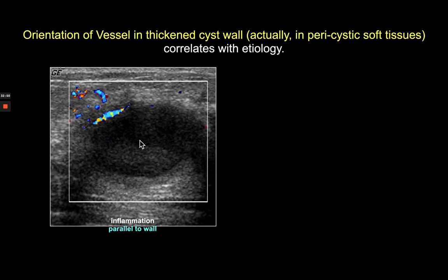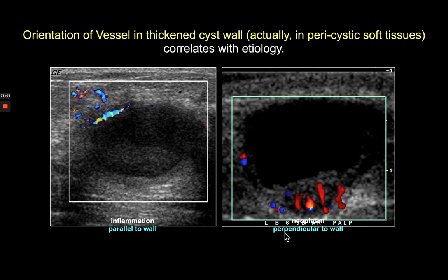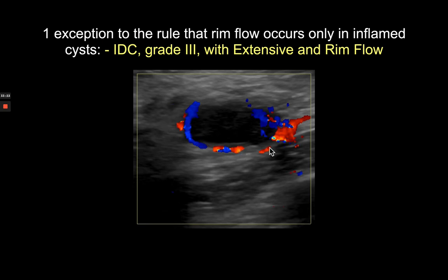In contrast, vascularity supplying an intracystic papillary lesion like papilloma or carcinoma is usually oriented perpendicular to the cyst wall, passing through it. The orientation of the vessel can be very helpful. A caveat: a triple-negative grade 3 invasive ductal cancer with extensive hemorrhagic necrosis can show only vessels in the apparent pericystic area because the interior has liquefied — a potential false negative mimicking an inflamed cyst, though this is uncommon.